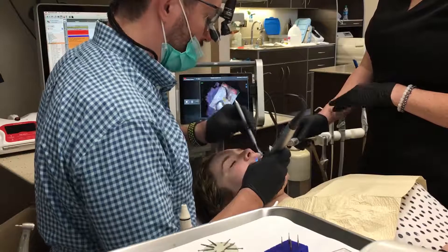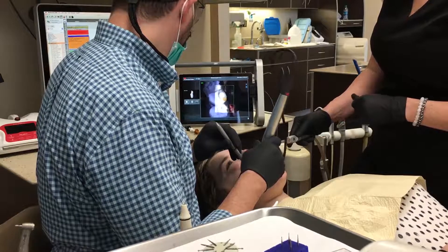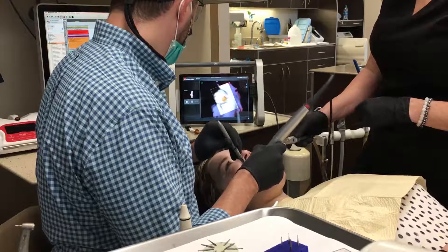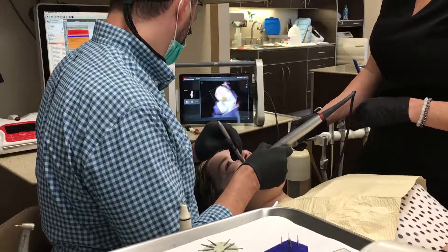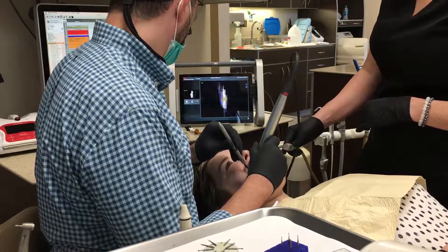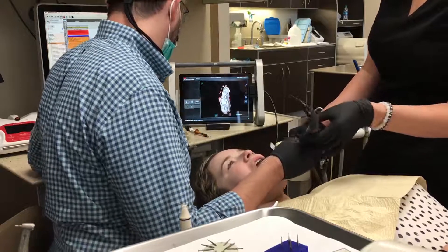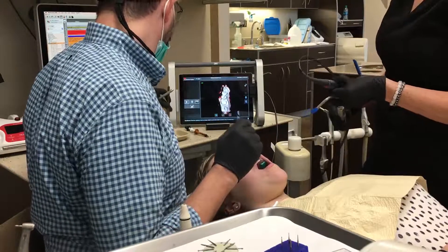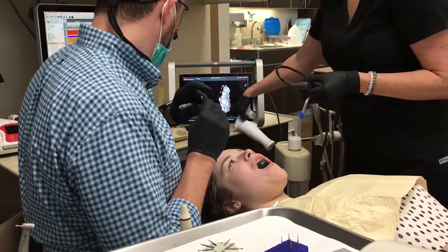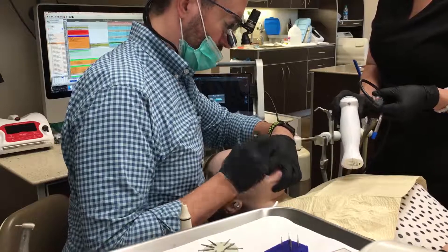I'm going to finish by going over the palatal of the upper teeth, then restart the scanner and go over onto the buccal to record the buccal. Once everything has turned white, you're pretty good. This scan took around a minute and a half total to do the operative arch. I look at this as a single unit crown on number three, so I would capture what you would capture with a triple tray impression — from the tooth behind it, the tooth distal to number two, up to the canine number six. That gives the lab tech plenty of information to fabricate a crown.